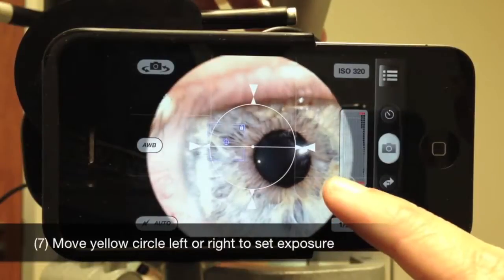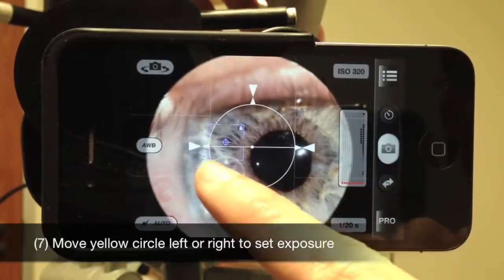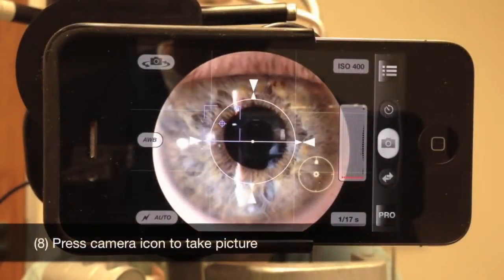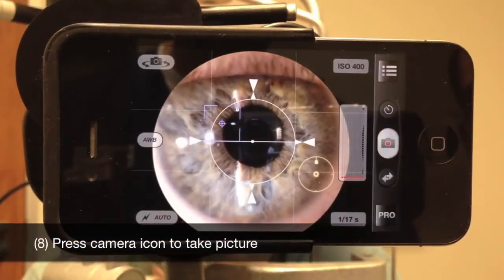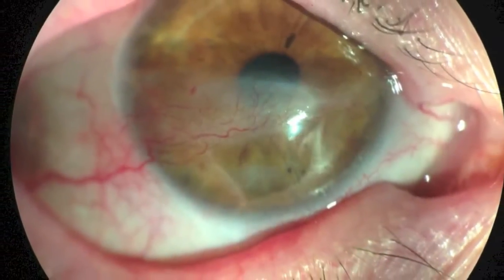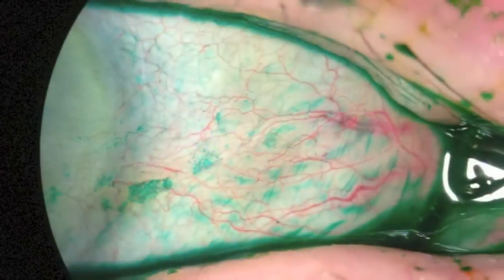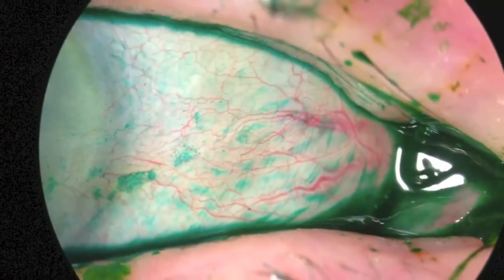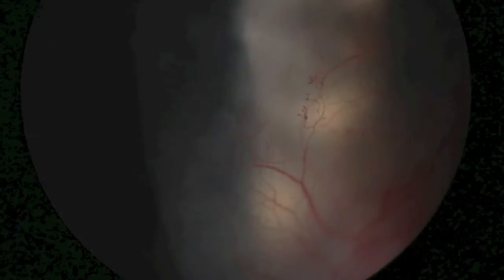Slide the yellow circle back and forth across the screen in order to find the optimal exposure. Finally, press the camera icon in order to take your picture.